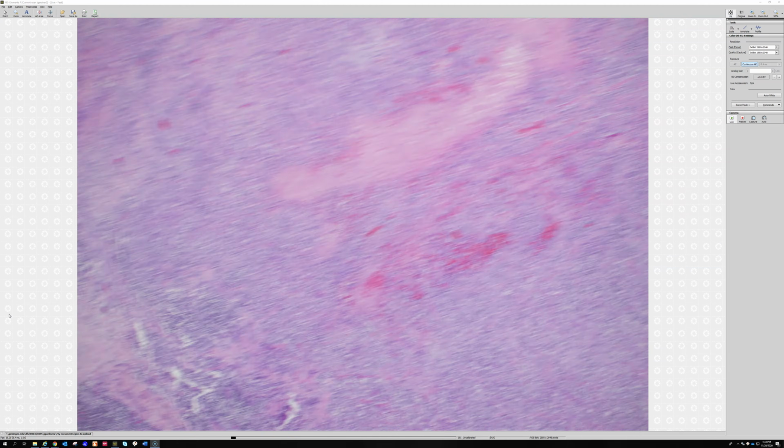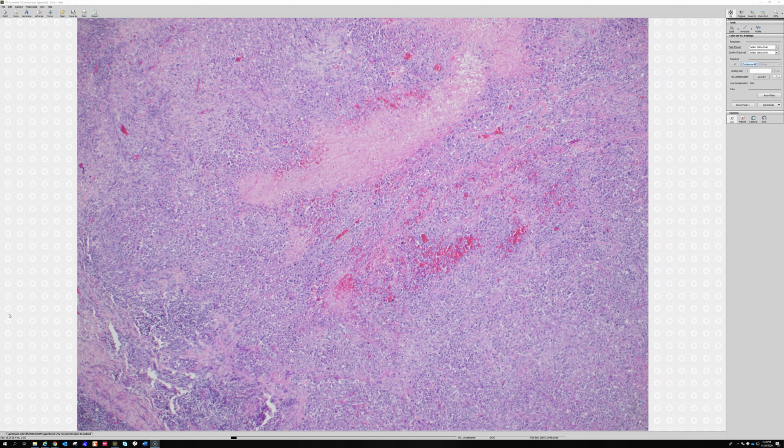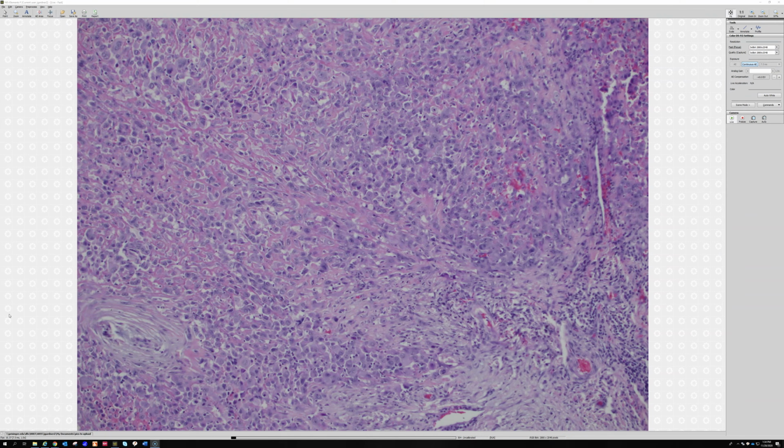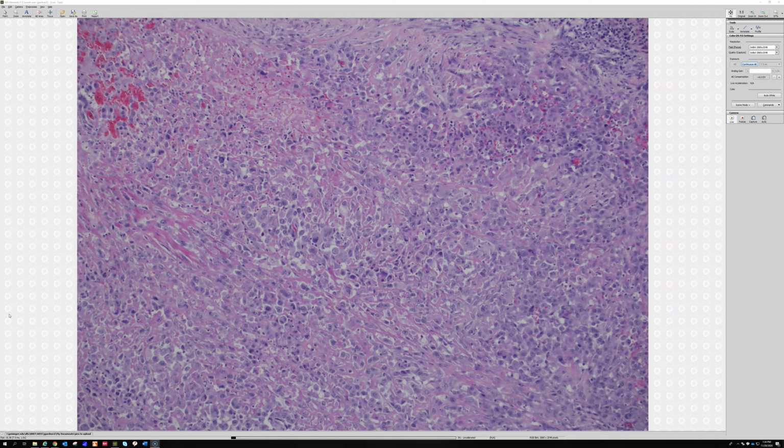If you see the blood, you could think of epithelioid angiosarcoma, which can sometimes have some similarities in staining. For example, ERG, which is a great marker for vascular things, stains about half of epithelioid sarcomas. CD34 tends to stain epithelioid sarcoma. CD31 should be negative. So you sometimes have to do a broader panel on these to exclude other things in the differential. But that is a good one to remember.